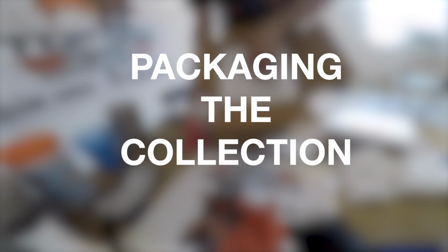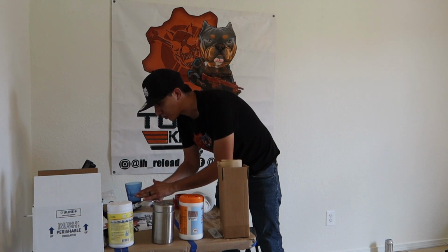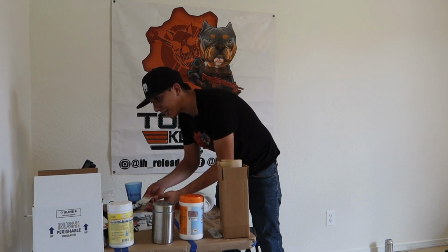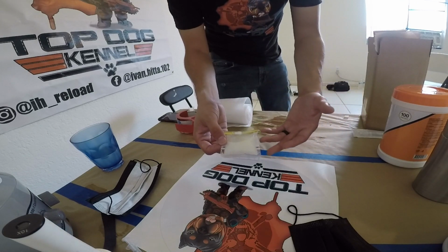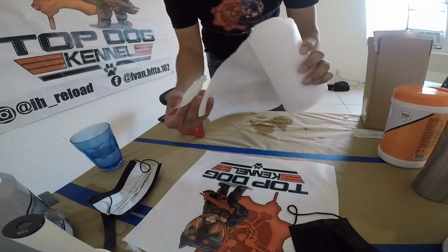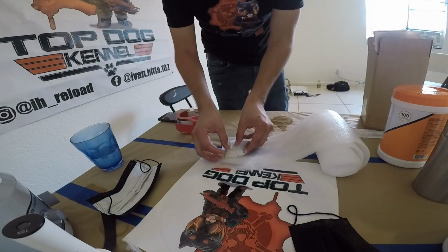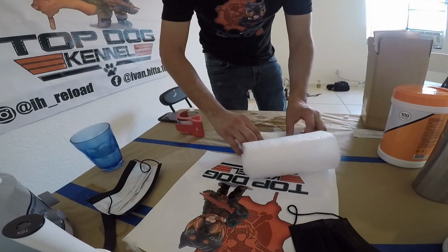The actual sample. You need to make sure that your sperm sample does not make direct contact with the ice. Doing so is going to shock the sperm, and pretty much your whole sample is now trash. So this can be done with just pretty much wrapping it in some kind of insulation paper. This is just packaging paper. This is all I use to wrap it up, and that's pretty much it. So you want to make sure you have a nice thick layer of it. I'd say a couple of inches on each side.